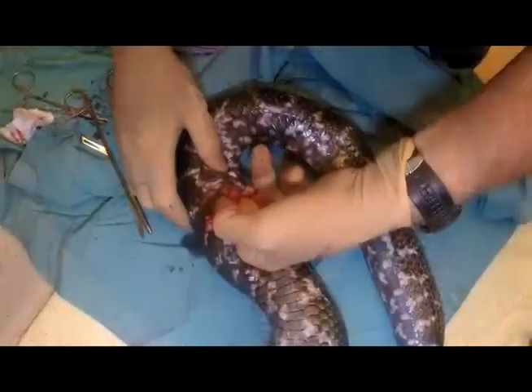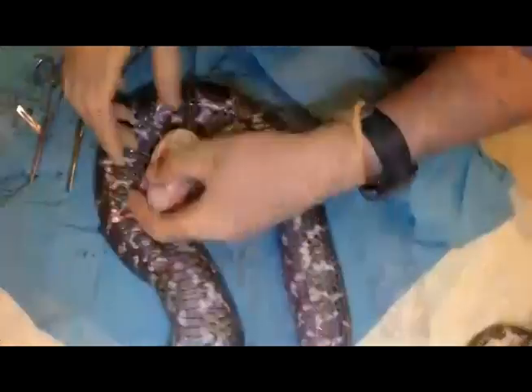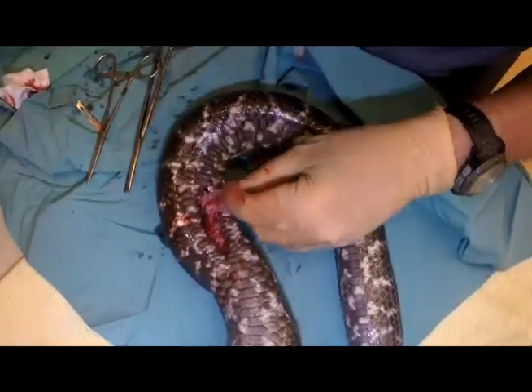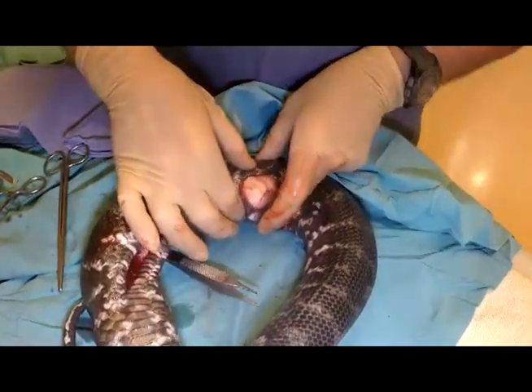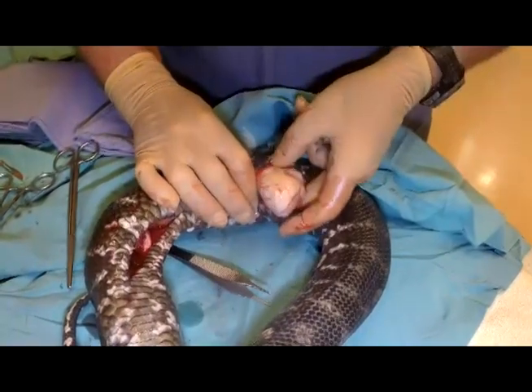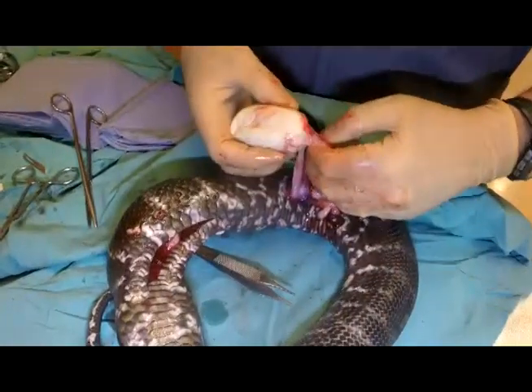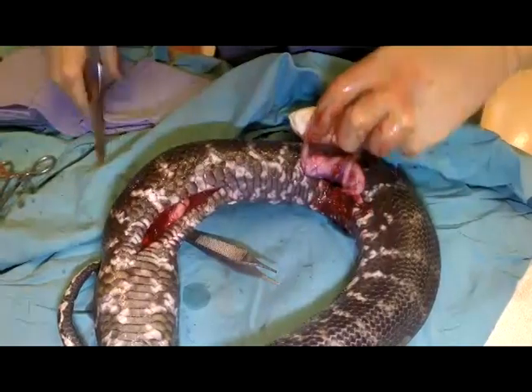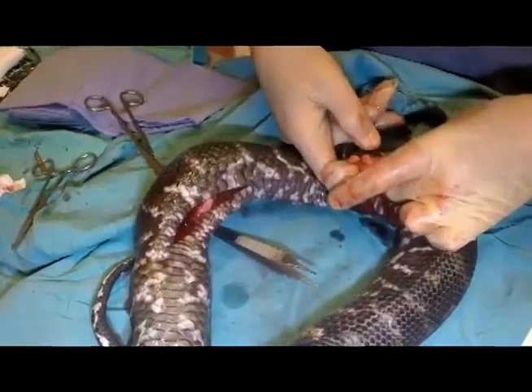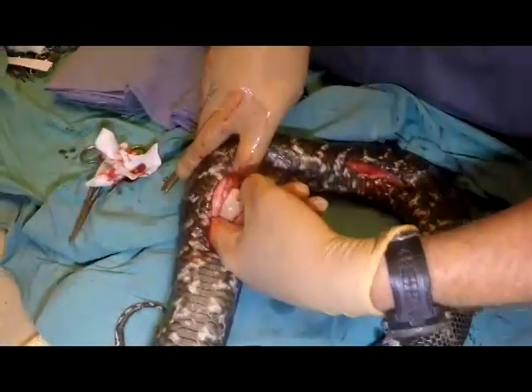It was, however, found that retrieving the eggs from just slightly back of this incision was very, very difficult. They didn't seem to want to be able to move. Perhaps we had some adhesions that had formed because she was overdue. So a second incision was made further back in the body cavity in order to be able to bring these out through a separate incision. This process was repeated over and over again, to the point of where we had removed 16 eggs altogether from the body cavity. And this was relatively straightforward.